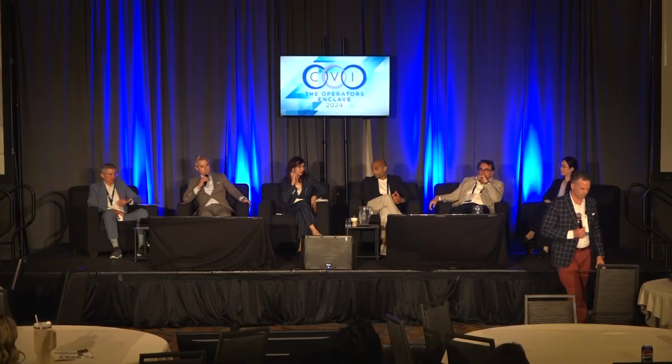Nick, that was a really elegant case. I felt a little anxious when you were disturbing the appendage with the pigtail, I have to tell you. Having recovered from that, I have a few questions for you. So had you thought about just going to ball? You could have used cerebral protection, but what about just going to ball and doing a no-touch technique with a Watchman device? I've done that in several applications, and not had any untoward events from that. And granted, the location of the thrombus was not ideal, but had you thought of that?